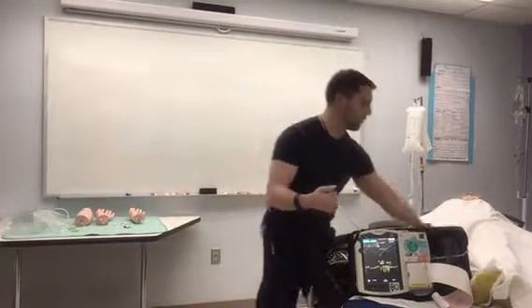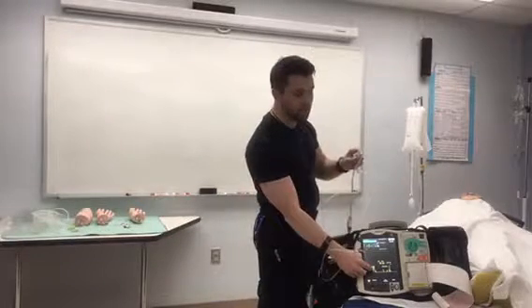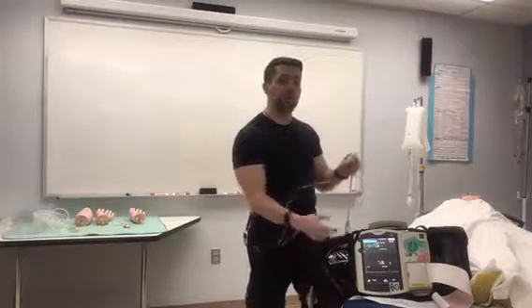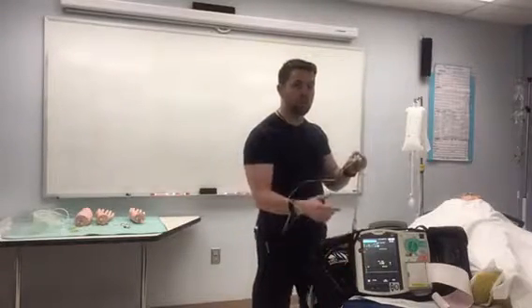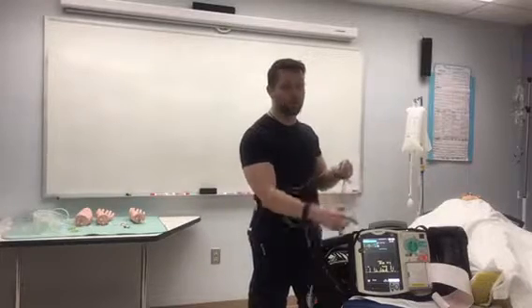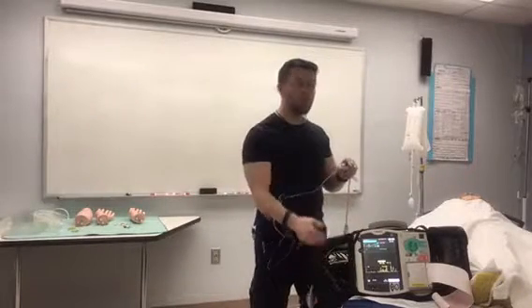So it goes until it gets to right here, and then it's picking up the variance, and it's deflecting and showing us that variance on the screen for us to be able to read it and see the quantifiable values. So we know whether or not the CVP is way low or way high. Same thing with our art line, same thing with our wedge pressure.